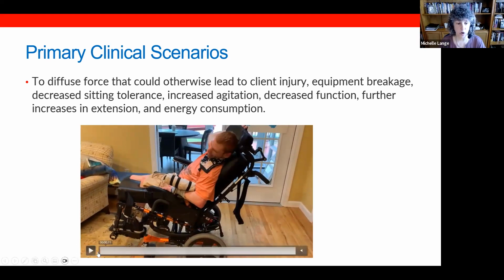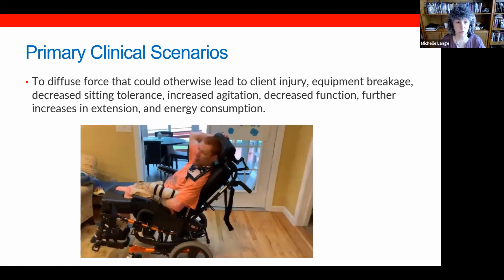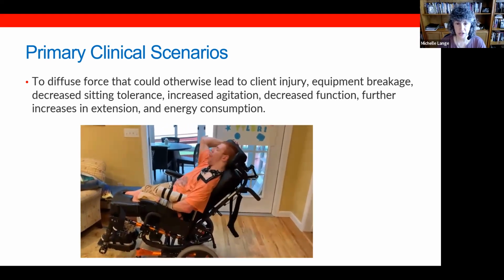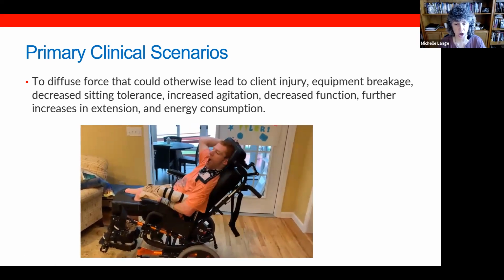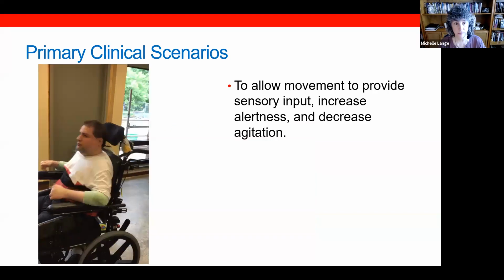He might be more agitated, have a decrease in function, further increases in extension as he continued to push against a non-yielding static system, and also using up a lot of energy.